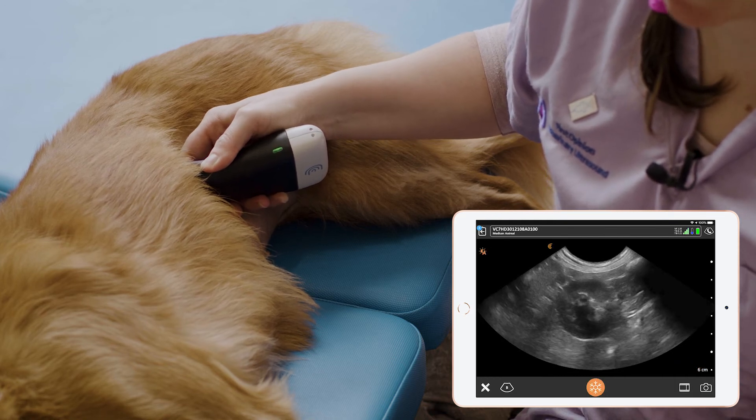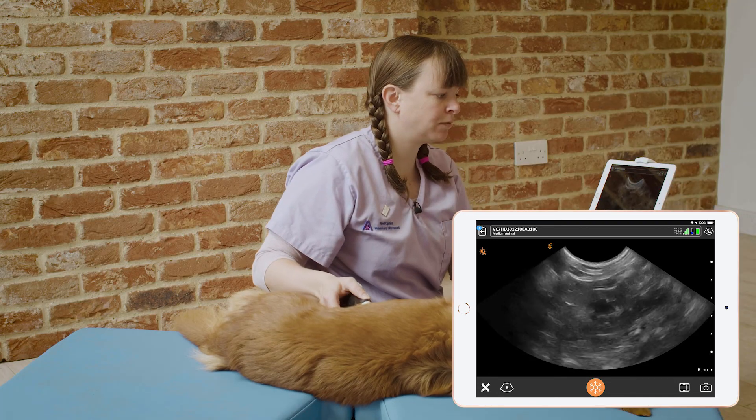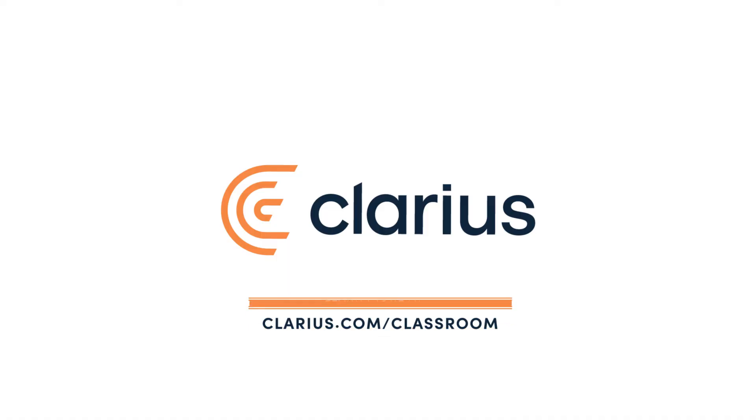And again we fan all the way through in both directions to see the full kidney in transverse.